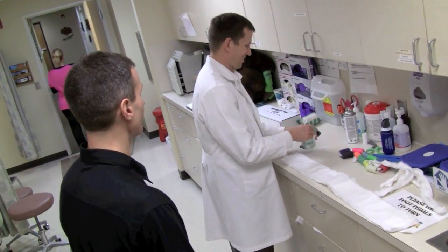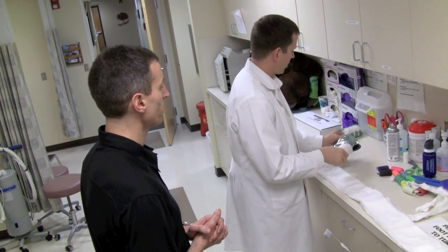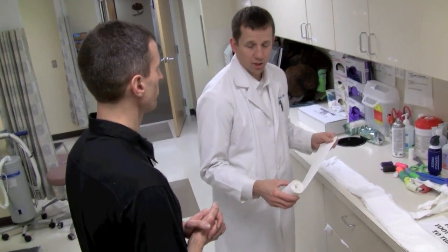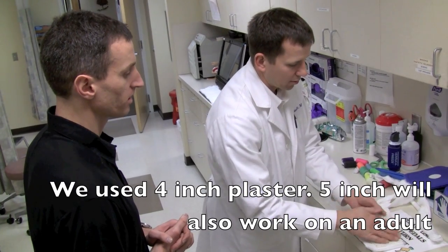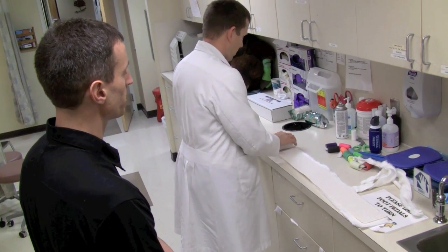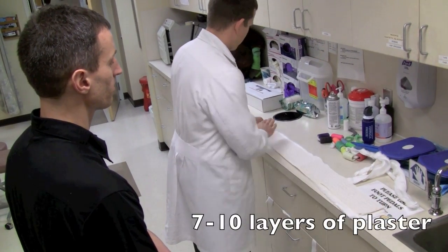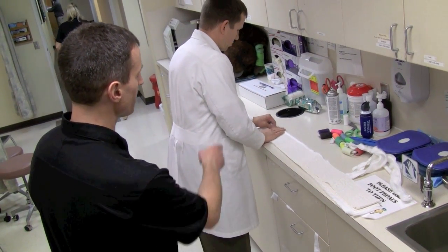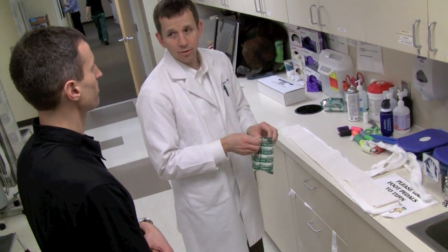That's a PhD-level technique. For the posterior splint, four-inch plaster is fine — it comes in rolls. They also come in five-inch sheets, which are five by 30. You're just rolling it out, making a nice crease at the end, and going for seven to ten layers. Usually you can get four or even five sheets out of one roll. If it's uneven, tear it off at the end — it makes it a lot easier to smooth out afterwards.